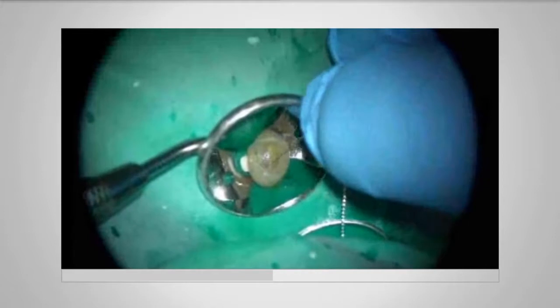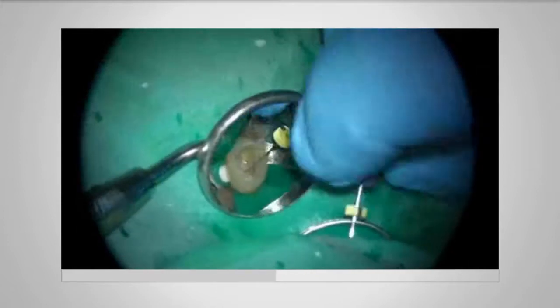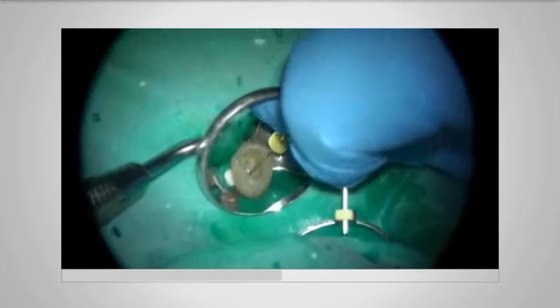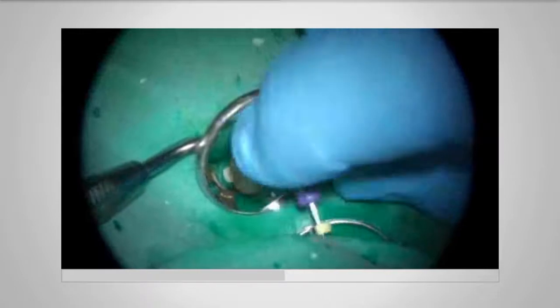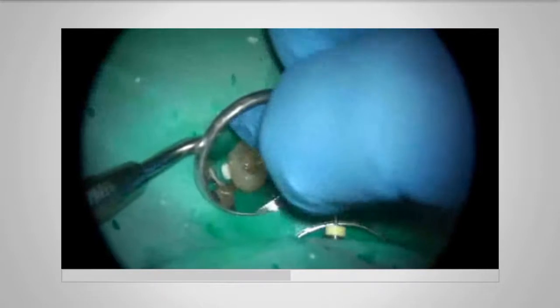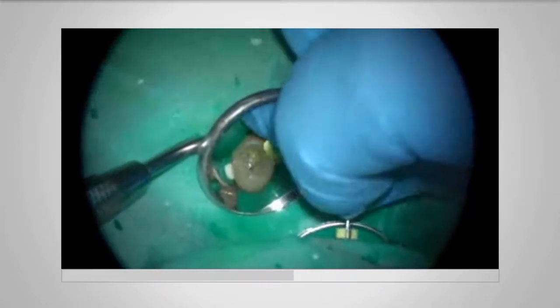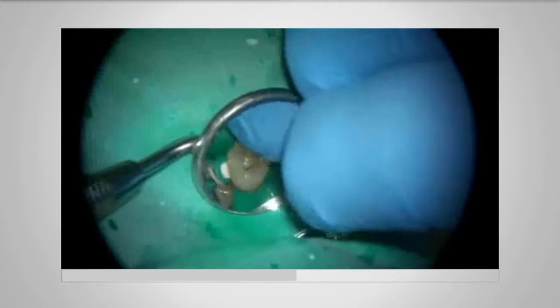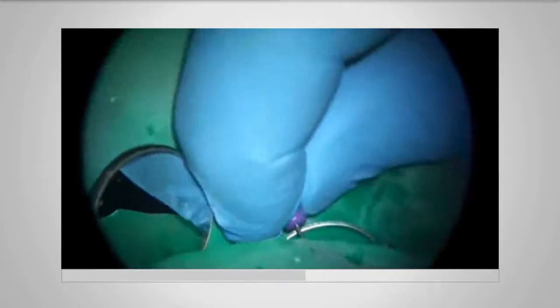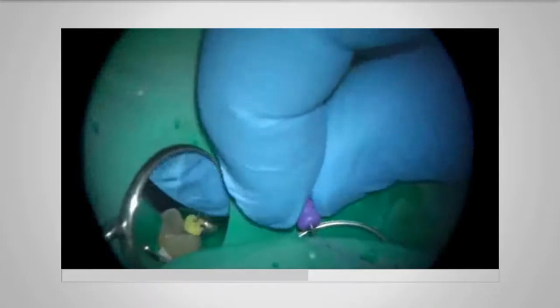Once the size 6 goes to the full working length, I'm now going to use the size 10 file with exactly the same action, gentle watch winding and small vertical filing action to make sure I'm patent. This is establishing my glide path down to the full working length. You can see when I get to the working length, I then just manipulate the file in the vertical direction a few times to make sure that that glide path is reproducible. There we go.